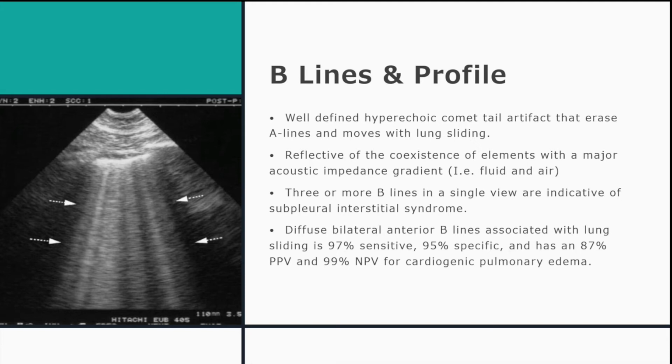And it has a 97% sensitivity, 95% specificity, 87% positive predictive value, and 99% negative predictive value.